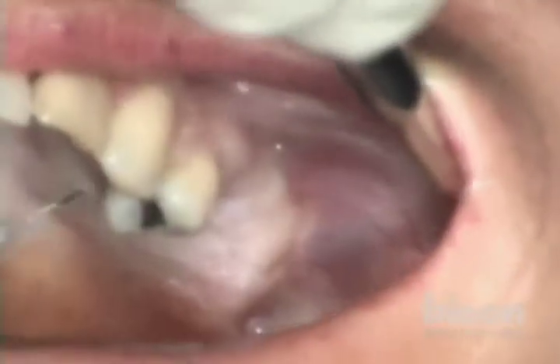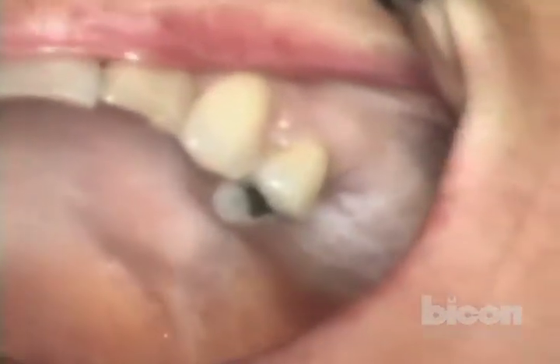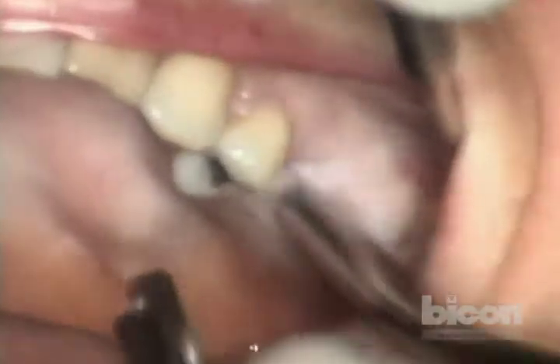The main reason we're able to apply this technique in this situation is because of the use of ultra-short implants — six millimeter or shorter. The incision we will make mimics a lateral sinus lift incision because it gives us visibility, but at the same time also gives us a sort of backup plan — if needed, we can expand this.